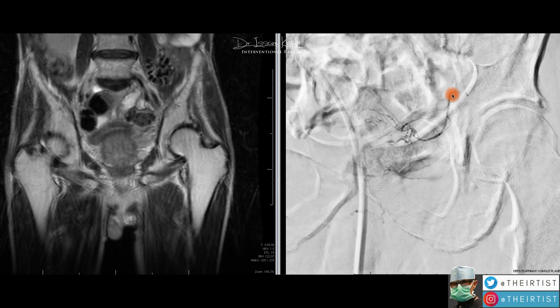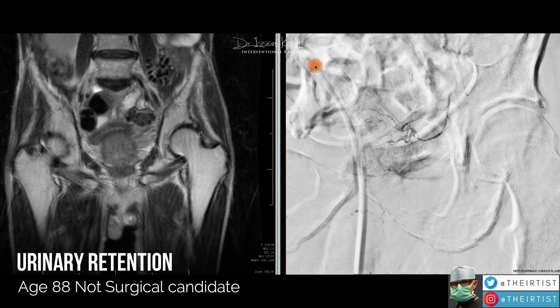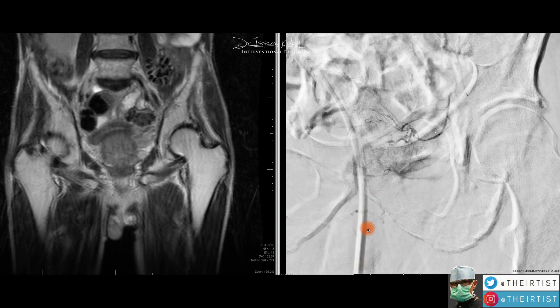The prostate artery embolization was done in this patient because he had issues with urination — he was in total urinary retention for many months, requiring a Foley catheter. Given his advanced age and inability to tolerate surgery, PAE was offered. The procedure went uneventfully and we were able to navigate all the way down to the left prostatic artery.